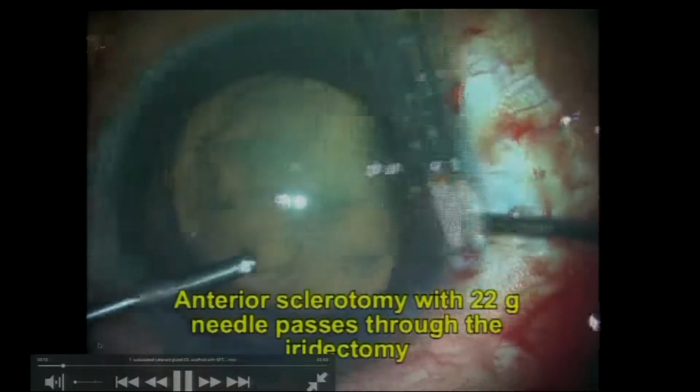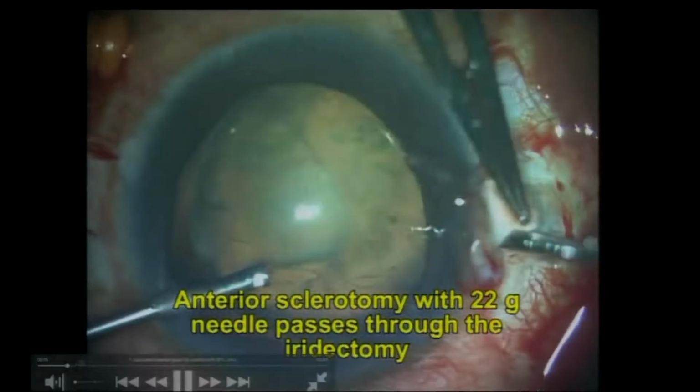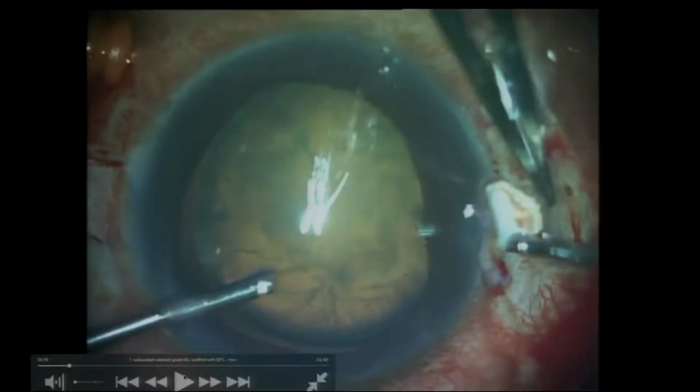Because it's a large eye, and I don't think many of you saw it, whenever you have a large eye, you really have to make a small peripheral iridectomy so that the sclerotomy that you're making under the flaps. So the flaps are made 180 degrees apart, 3 and 9 o'clock position. Once you do that, you make sclerotomies under the flaps about 0.75 to 1 millimeter behind the limbus. Once this is done, you make the peripheral iridectomy.